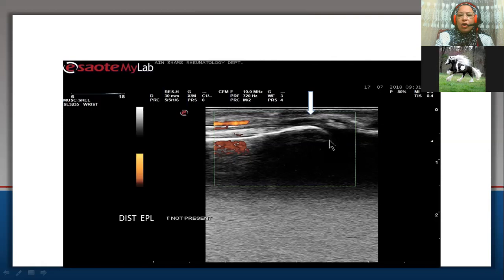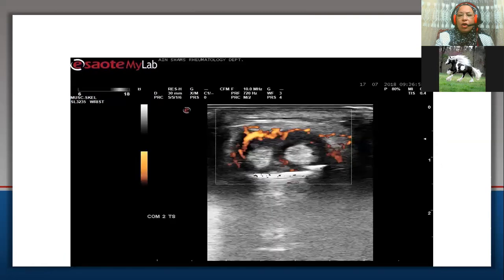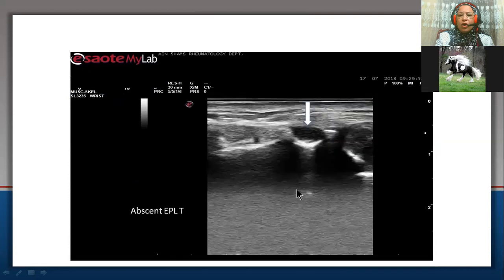So please don't miss the presence of a torn, absent tendon, especially in presence of nearby infection. Sure, in this patient, it's not suitable to inject the second compartment with tenosynovitis with steroid in presence of nearby infection. So please don't miss this.